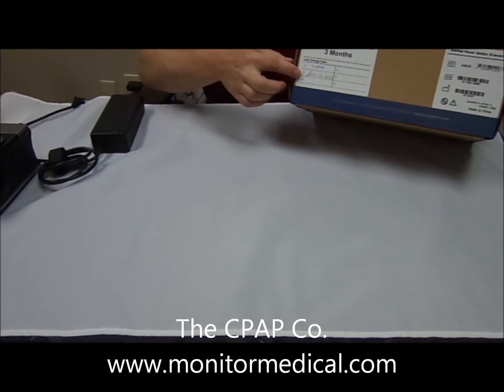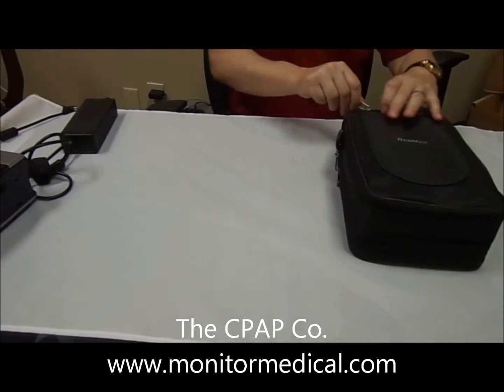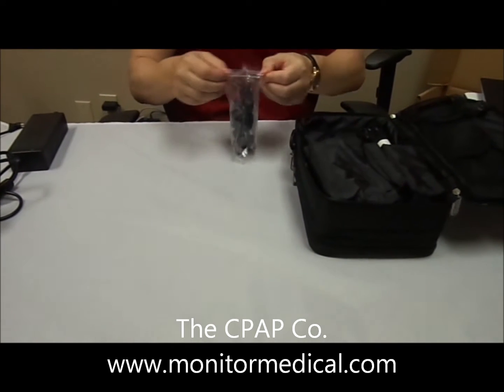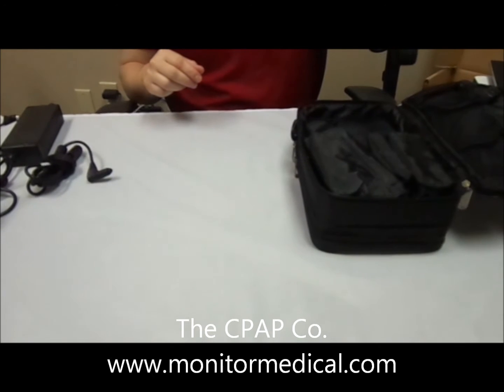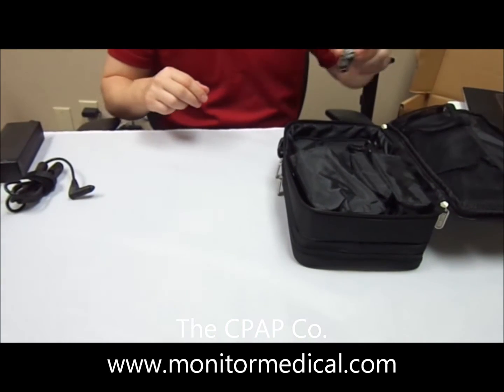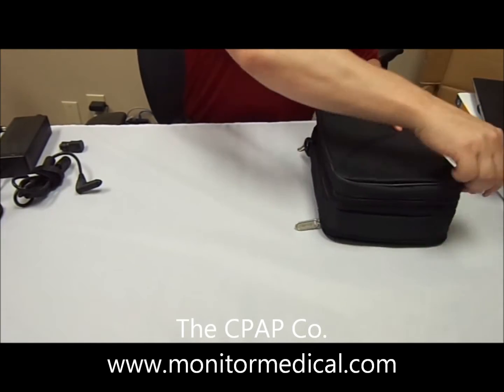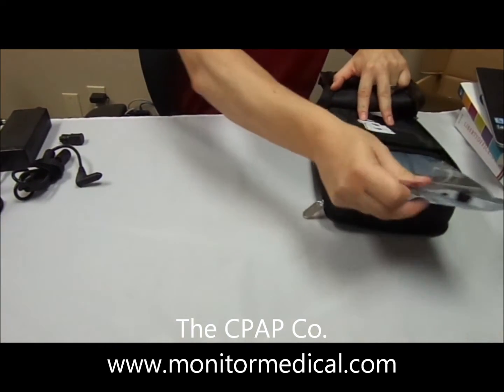You'll notice the first thing you'll see is the last date of full charge. Opening up the carrying case on one side, you will find the DC cable, a convenient carrying strap for the case, and the PSU adapter for charging. On the other side is the actual ResMed Power Station 2.